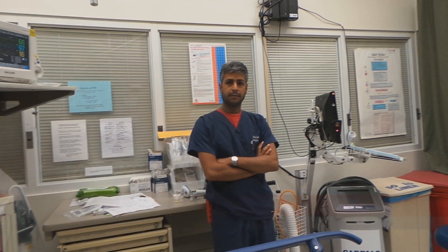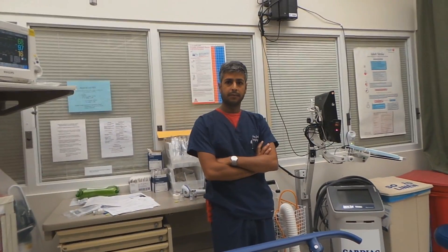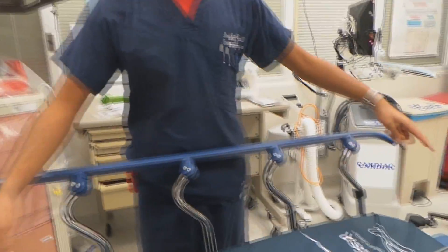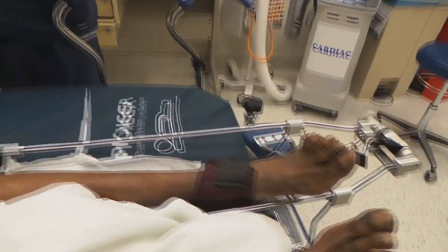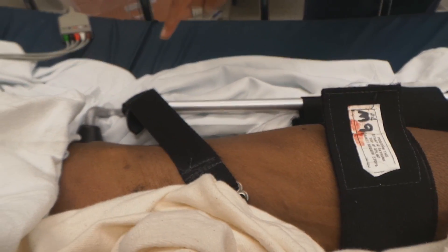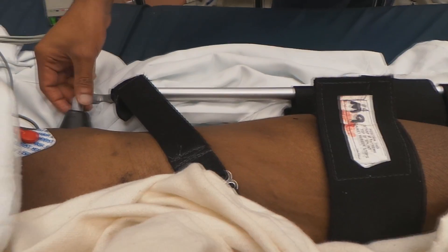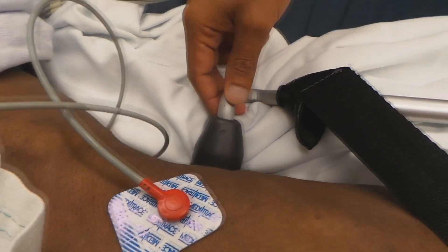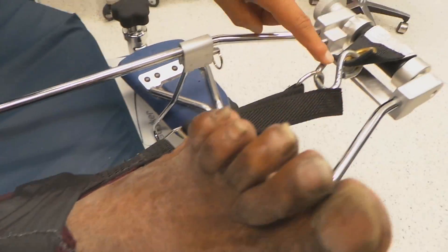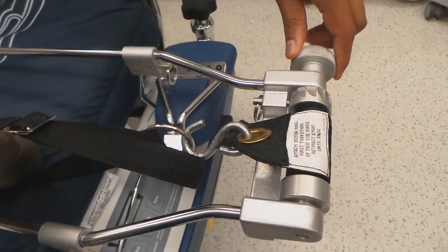Dr. Johnny, thank you. You're going to tell us a little bit about how to put on the Hare traction splint. So this is a Hare traction splint. We have three straps here: a high thigh strap, the top of the splint which goes just behind his butt, and if you come down the splint we have an ankle collar, a hitch, and a traction mechanism.